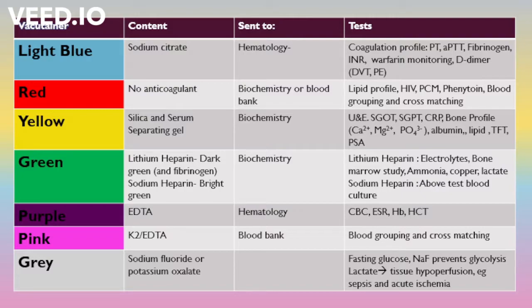So as to ease the purpose of remembering the tubes, I'll go by the commonest first, and then in the next slide we'll go by the order. The table here has the proper order in which you have to take the sample. So let us first look at the commonest tubes that are used.